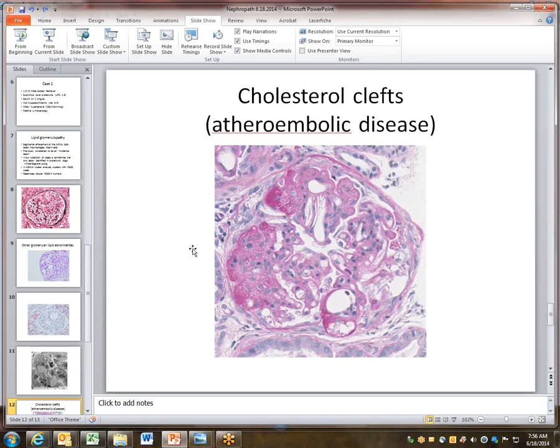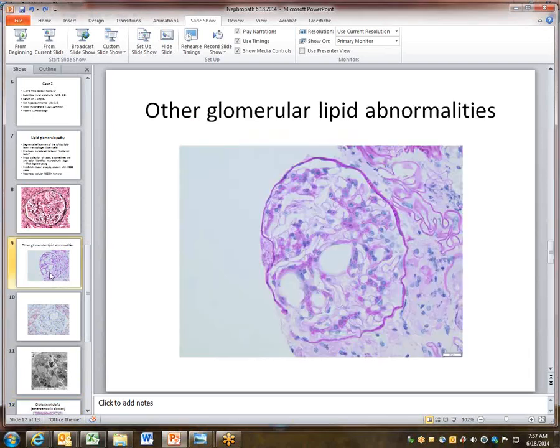And we had one question here from OSU. Would you predict that the lipid embolus in a glomerulus could progress to that sort of thing by itself? That's a very good question. I've had that exact question as well. Could a glomerular lipid embolus, like the ones that we saw, just clear space, progress to the case that we had as a discussion with the foam cells? I haven't seen any kind of progression within a single biopsy core.